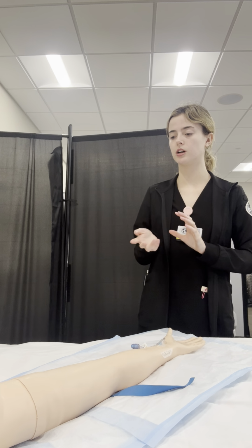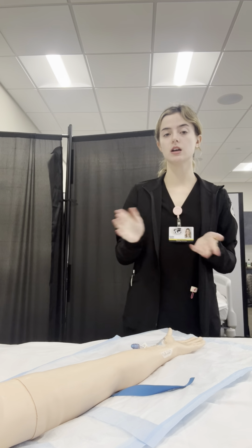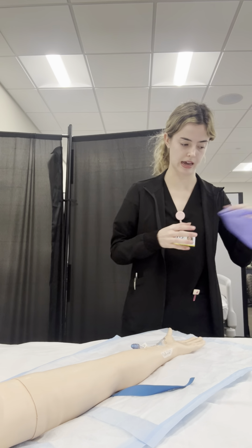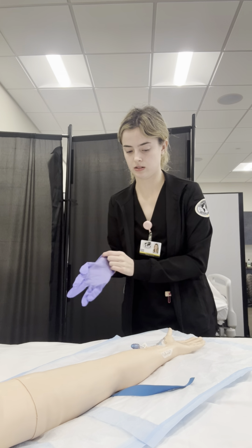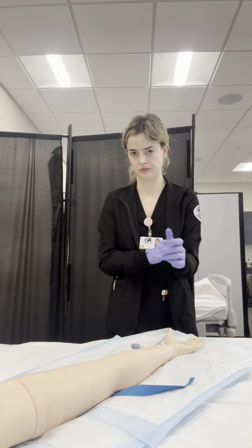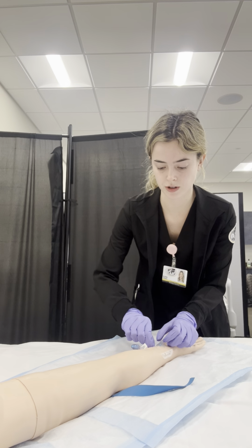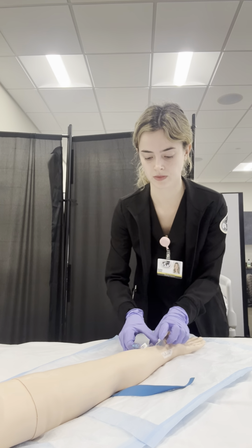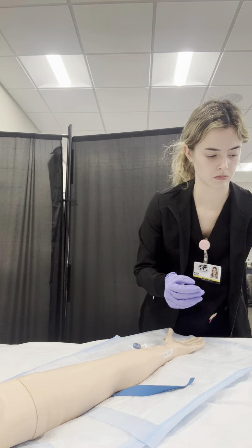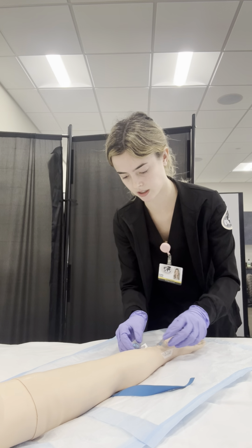So your doctor has ordered to discontinue your IV. So I'm here to take that out for you. Is that all right? Okay. Patient has consented to me discontinuing their IV. So I'm going to go ahead and put on gloves. I am going to remove the tape that's on the extension set. And would have a trash can right next to me as well.